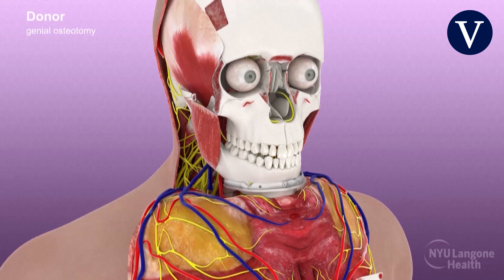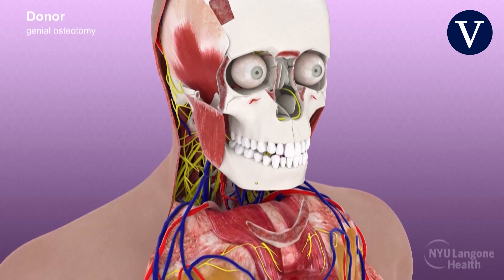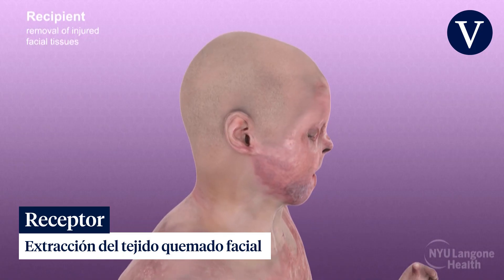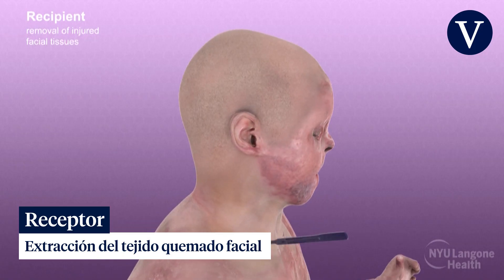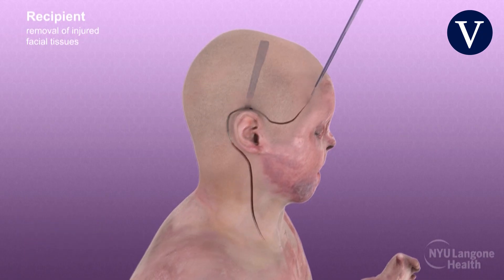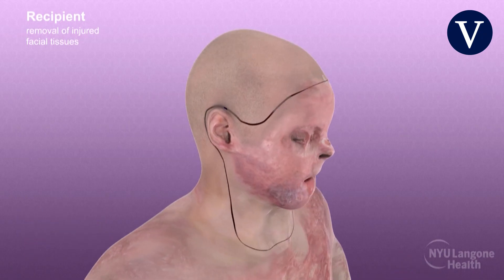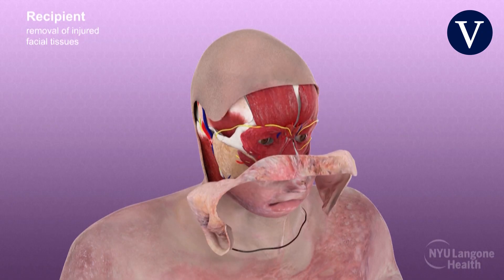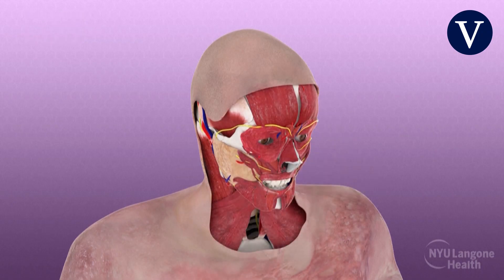A genial cutting guide was then placed and geniotomy was performed. Concurrently, the recipient underwent surgery to excise injured and scar tissues and recreate defects for precise adaptation of the donor face. A hairline incision was used, with subsequent removal of external scar tissue along the neck, ears, eyelids, and face, and the dissection of essential structures.